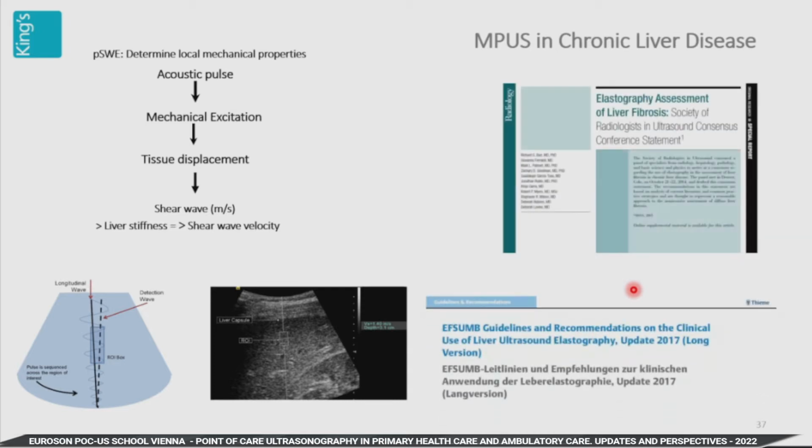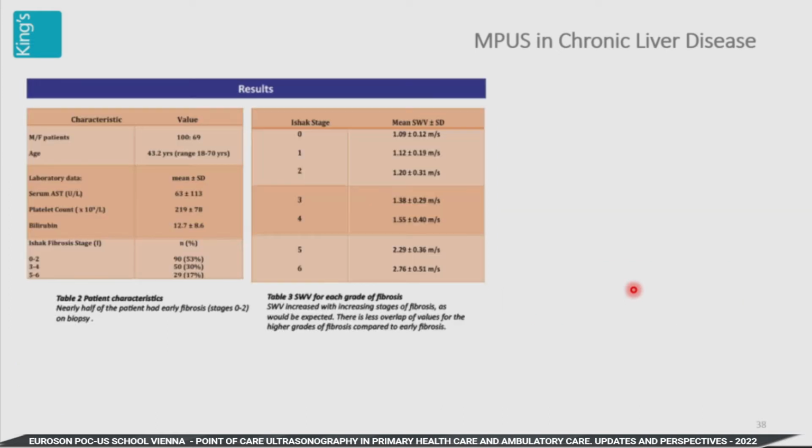You're plotting up against the fibrotic level of the liver, and this is usually the METAVIR score, and it's graded 0, 1, 2, 3, 4, where 4 is cirrhosis. But at King's College Hospital, we are different. We use the different scoring method, the Ishak scoring method for level of fibrosis, which has got 6 scores. And so we've had to set up our own measurements.